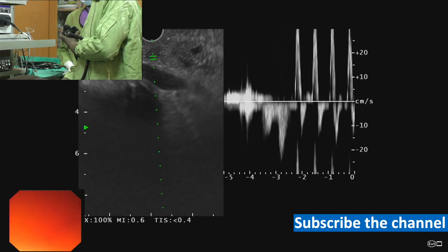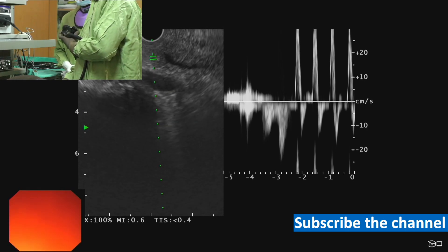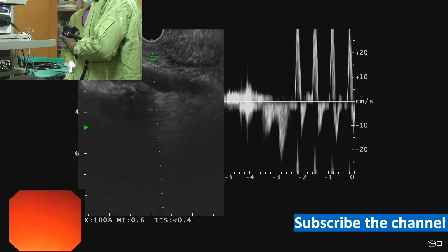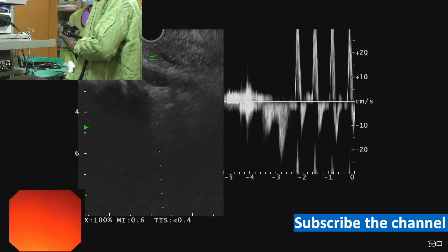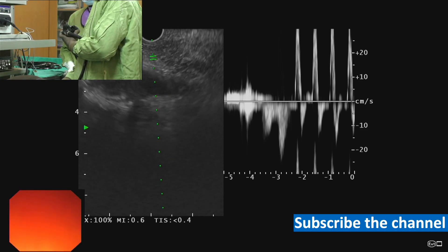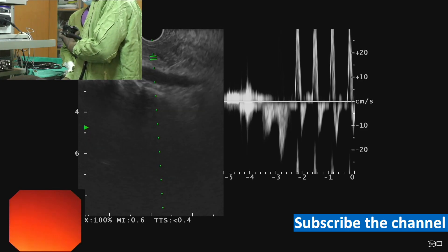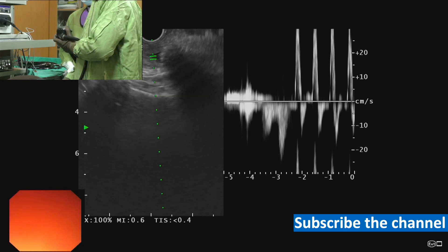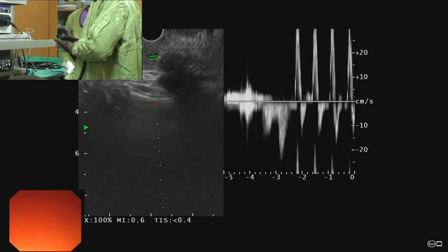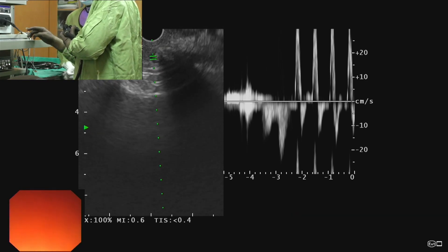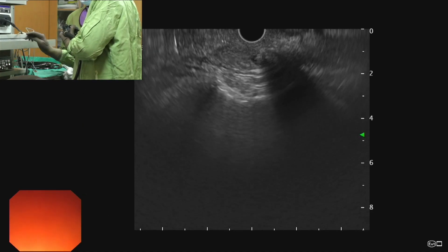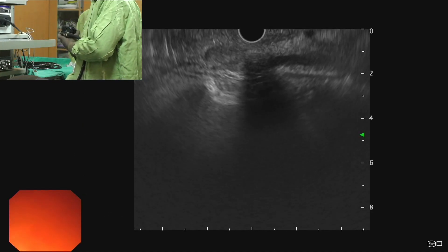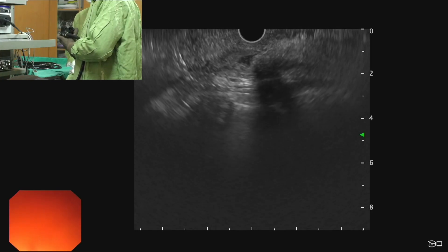Here we see two ducts: one is the pancreatic duct — the duct which is rising towards the papilla is the pancreatic duct. If we rotate the scope anticlockwise on the pancreatic duct, we see another duct — that's the bile duct. We can see a stone in the bile duct.